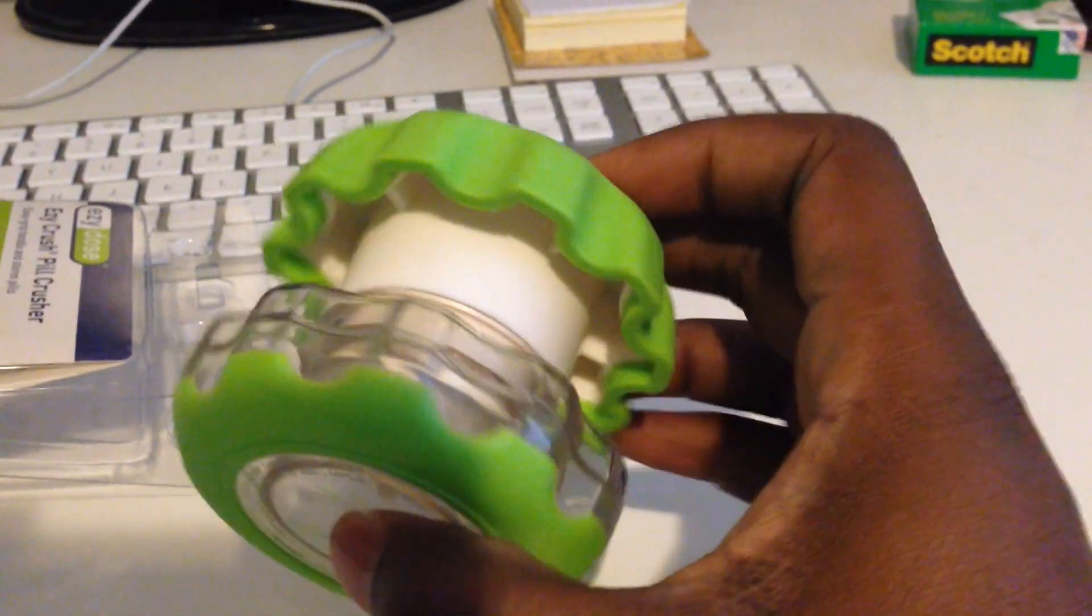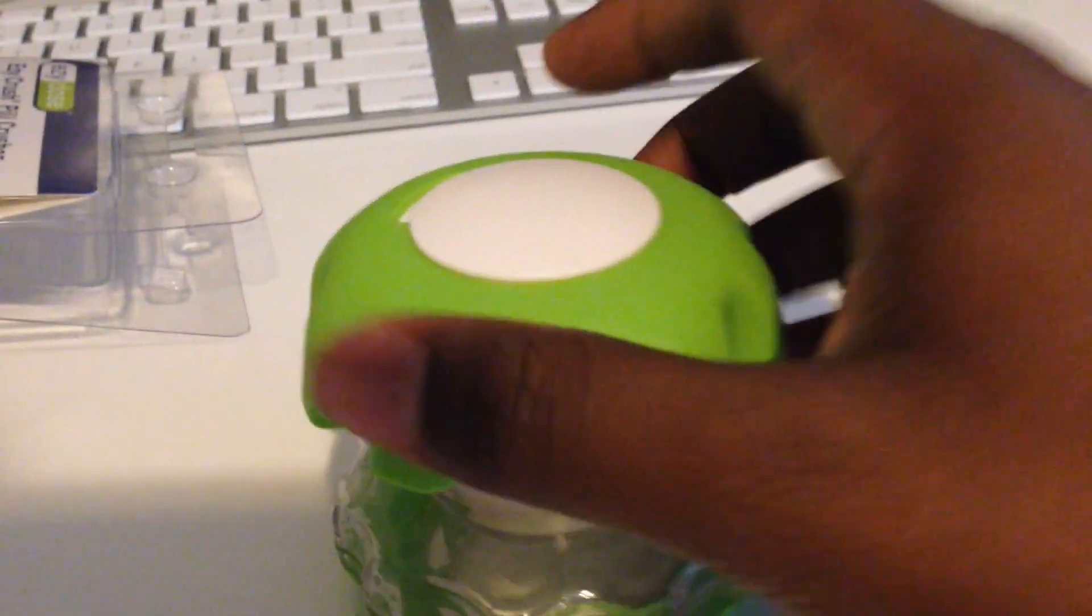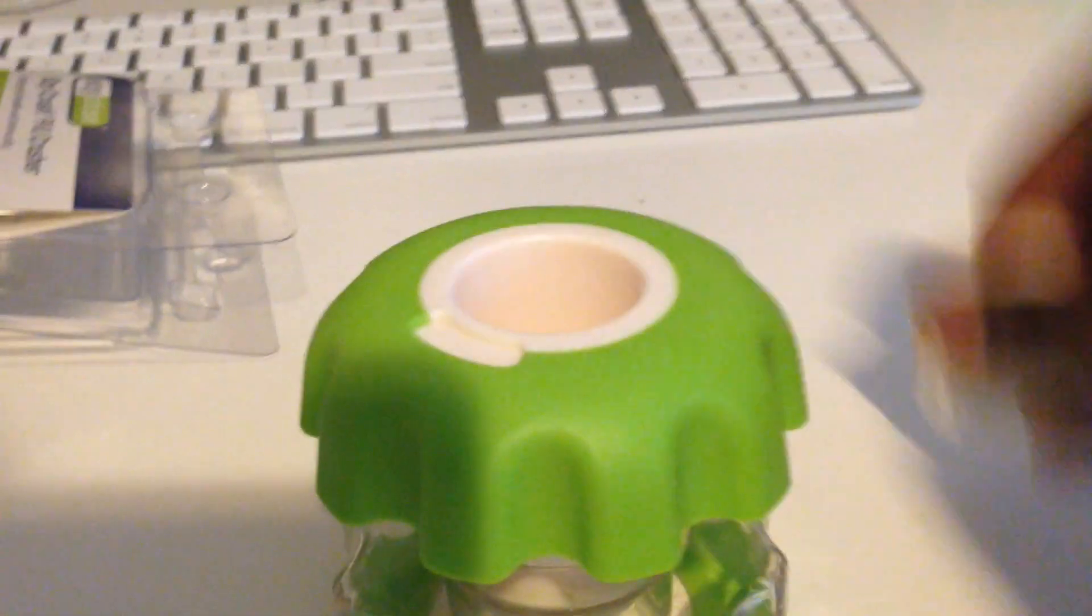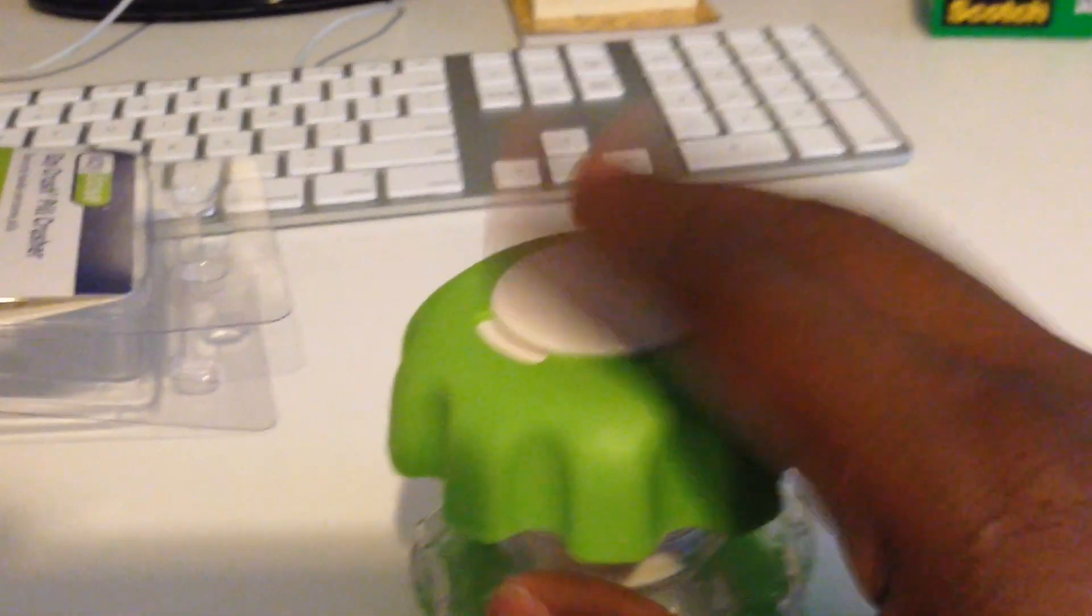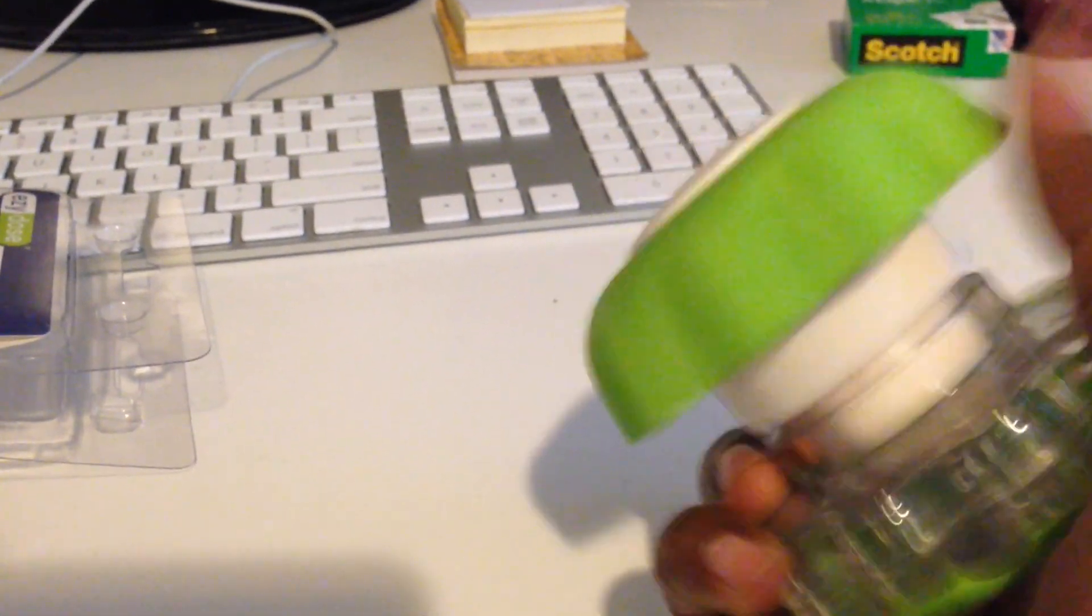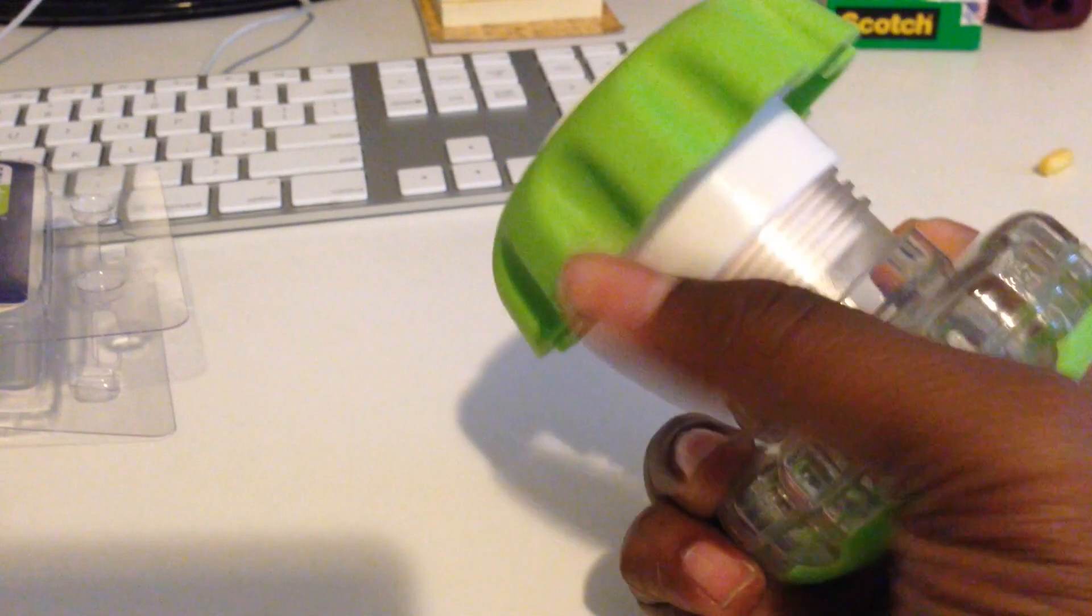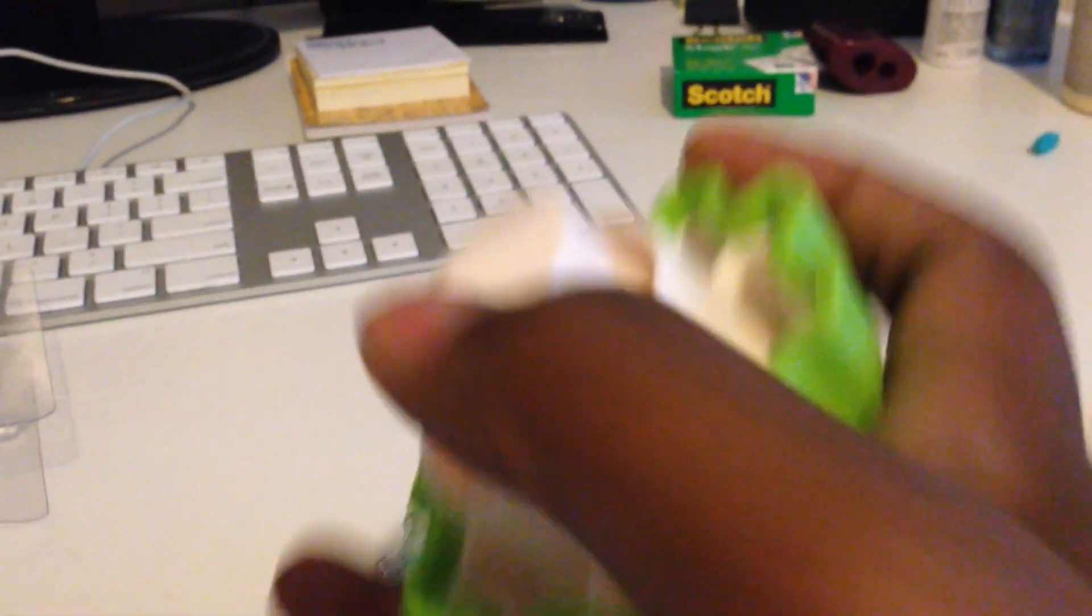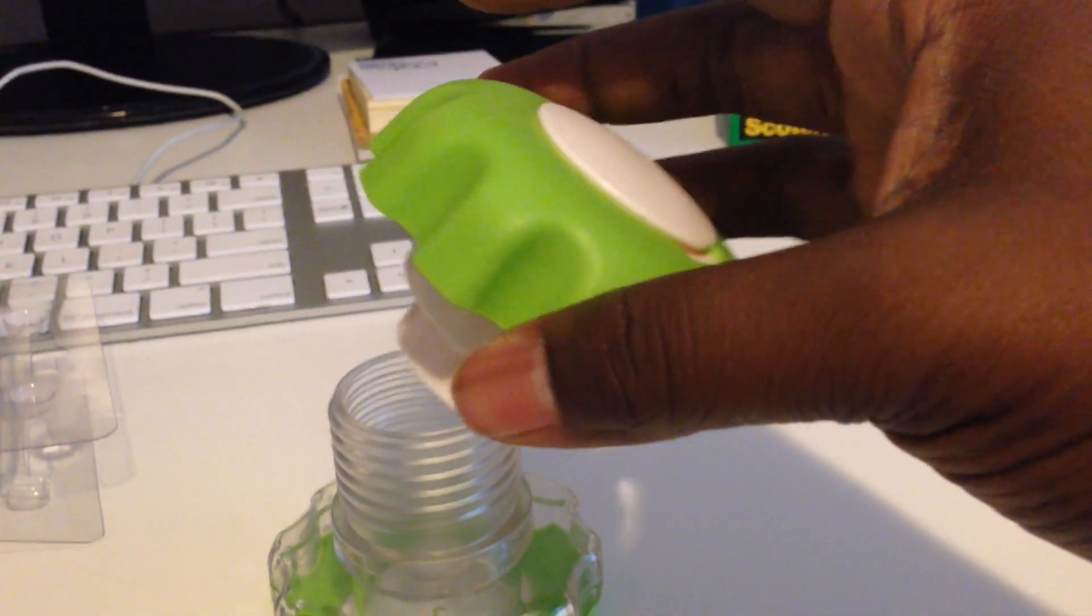Alright, so here it is. Up top there's a little compartment for you to store your pills, and it's actually a screw mechanism. So here's the crusher part. You basically just put the pill in there and you screw it down and while screwing down this crusher part basically crushes the pill into powder.